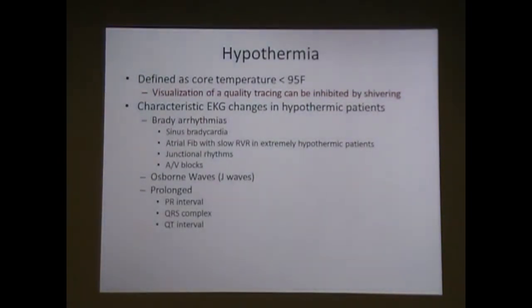You can get prolonged PR intervals. QRS complexes can be prolonged, and definitively your QTC will become longer. You can develop VTAC or VFib.